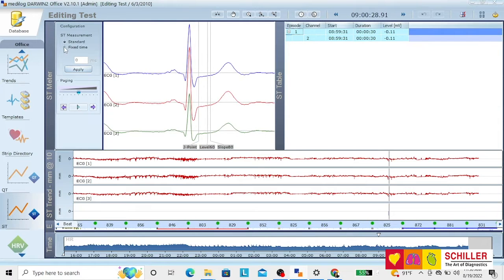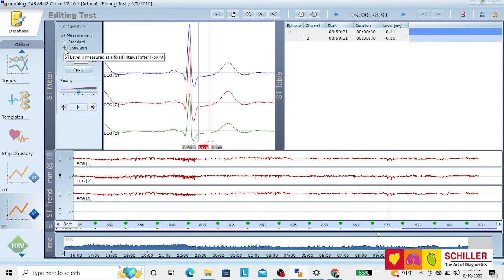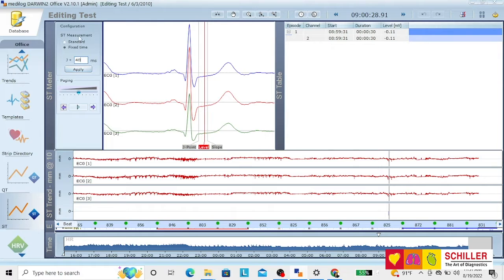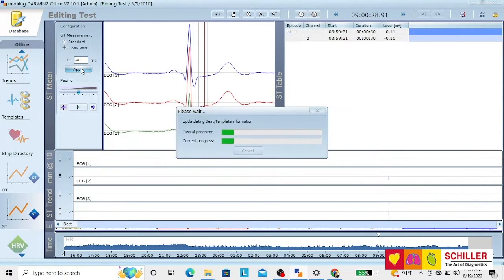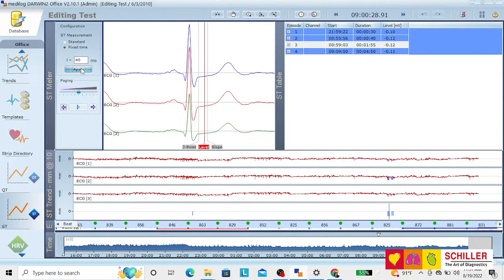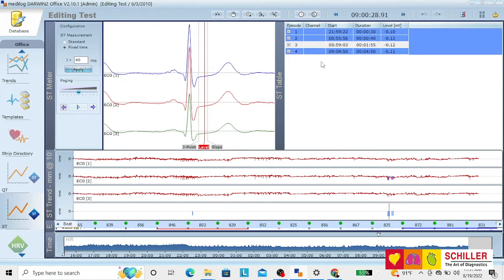You can use the standard measurement, or you can also change to fixed time. For example, instead of measuring at 70, we will measure at 40 milliseconds after J-point. We apply it. And as you see, now we have several other events because we changed the measuring point.